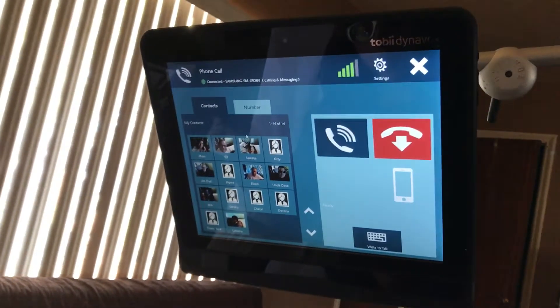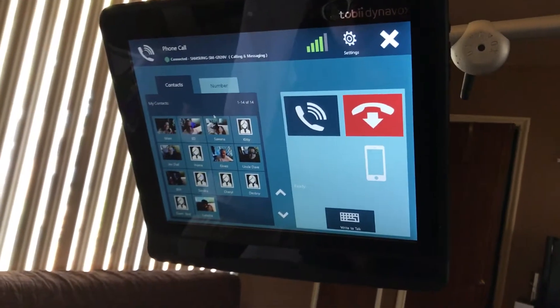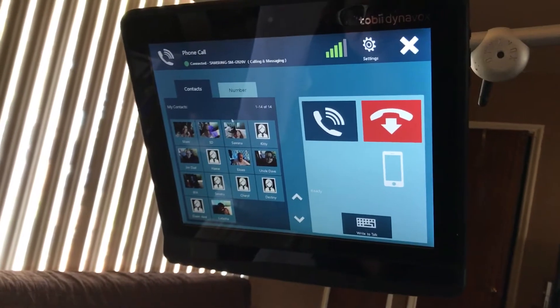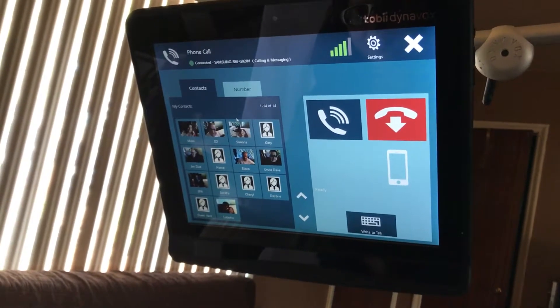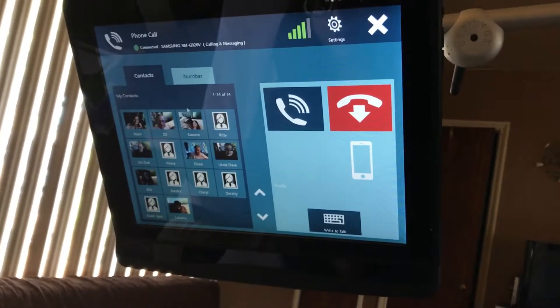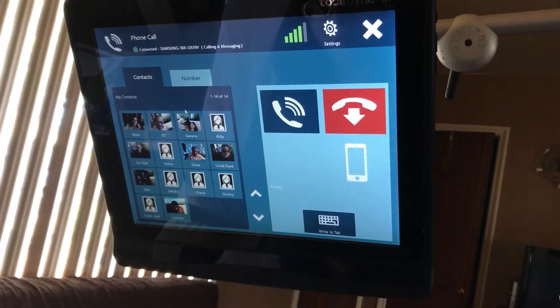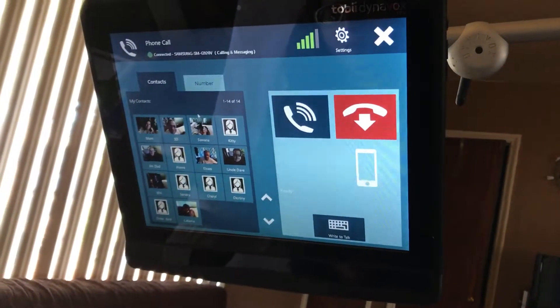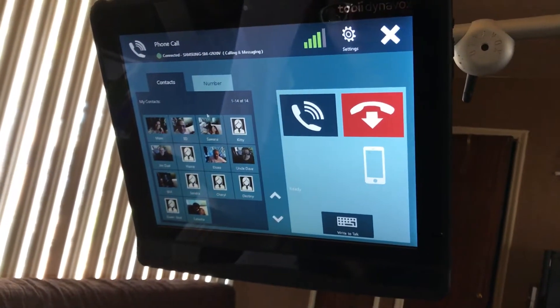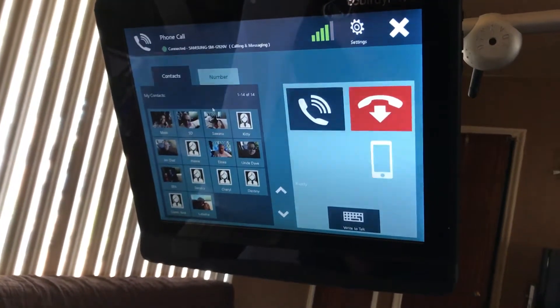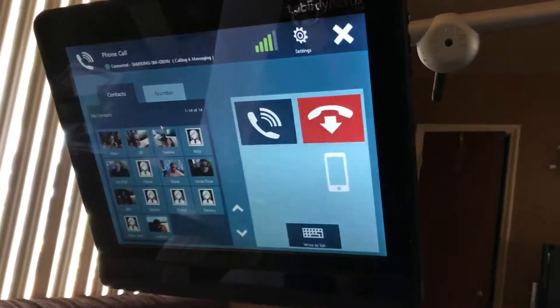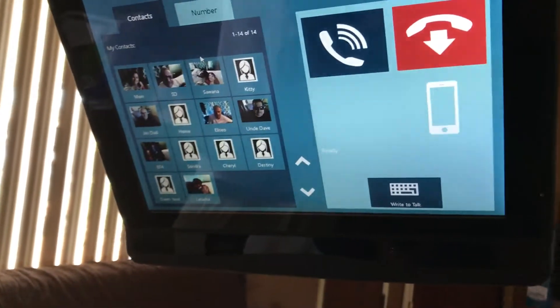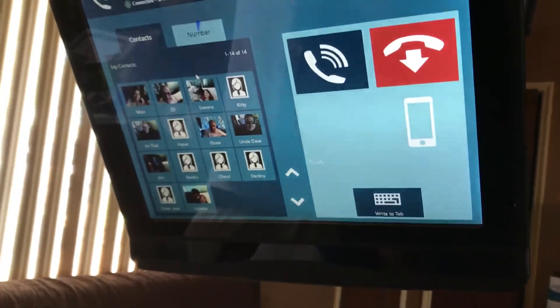So now she's selected the phone contact list. She's trying to call her stepdad. So you can see how many opportunities, how many tries she has. I'm trying to get that right. You can see the clock. Choosing, choosing, choosing.